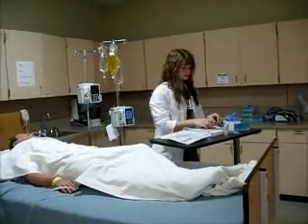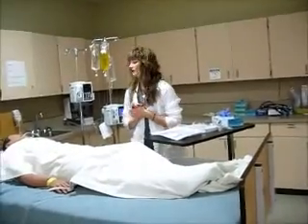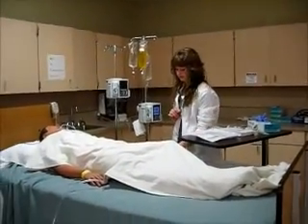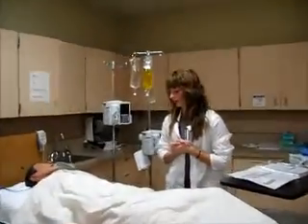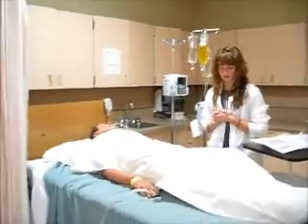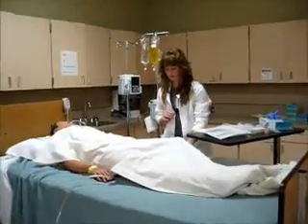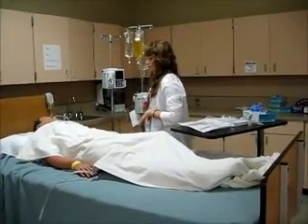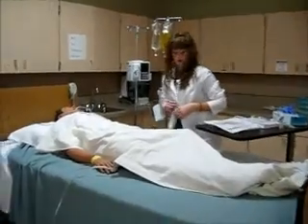Alright, so I'm going to come into my room. I'm going to introduce myself to my patient. Hello, Mr. Smith, I'm your nurse today. We have a new order for you for a bolus of 8 units of insulin. So I'm going to give that right into your IV, and then we're going to hang a bag, and we're going to infuse 8 units per hour.